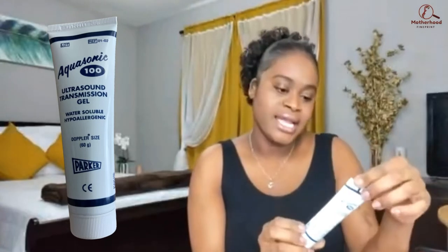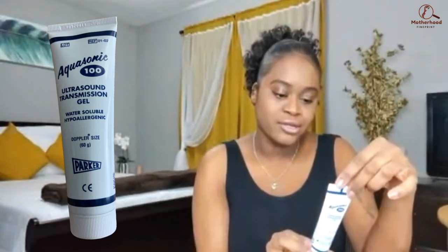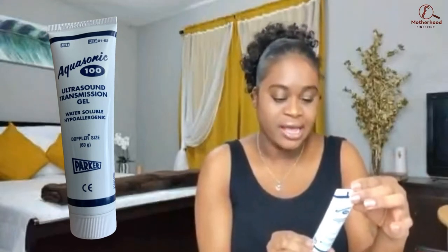Next we have the ultrasound gel. You can get different sizes of gel. I opted to get this smaller tube because I didn't think I'd need a lot — it is the Aquasonic 100 ultrasound transmission gel, water-soluble and hypoallergenic, and it's the same one that my doctor used at my appointment. I also have two small sample packets because I did end up running out and my doctor gave me three sample packets.